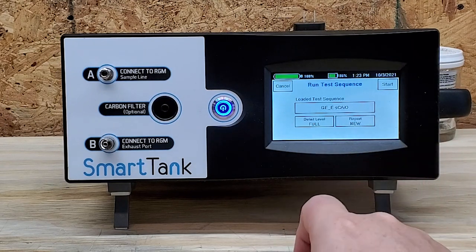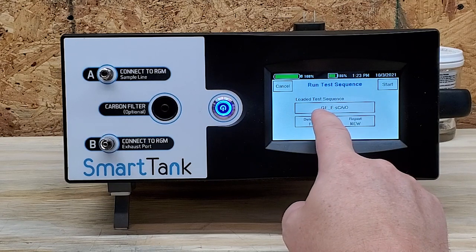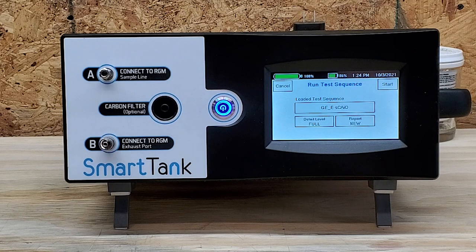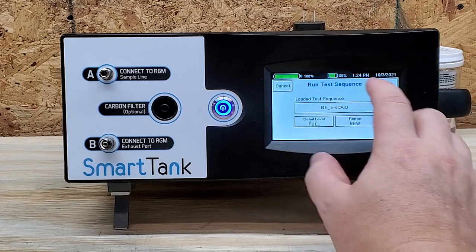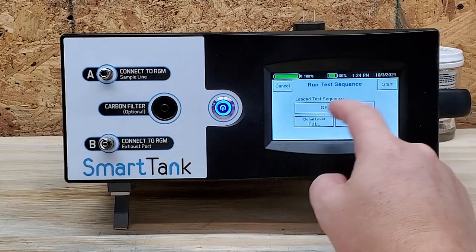I hit Automatic Test Sequence and it starts you right out with the GE ESCAIO, which is one of the most common devices that we are going to be testing. The GE ESCAIO is a multi-gas analyzer you're going to find usually around anesthesia machines, and that's one of the reasons we have that particular cal gas in there — it also has desflurane and some other anesthetic agents.